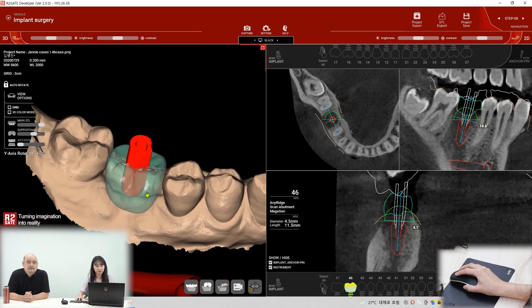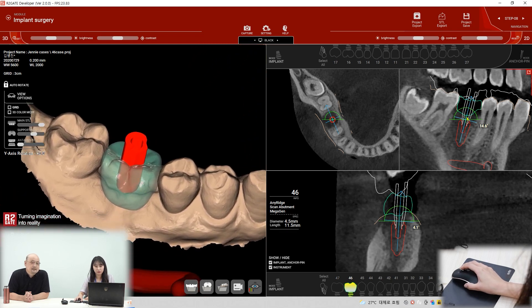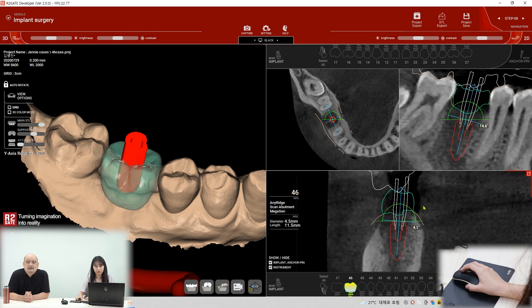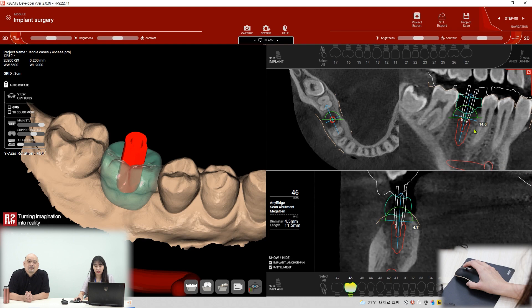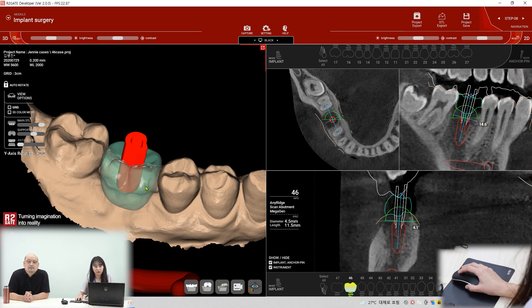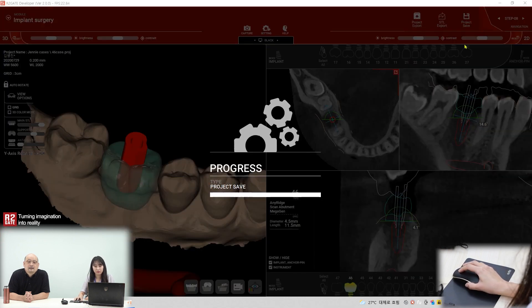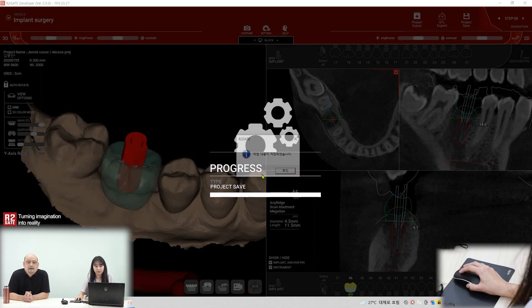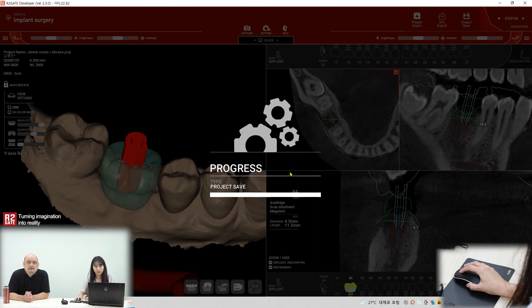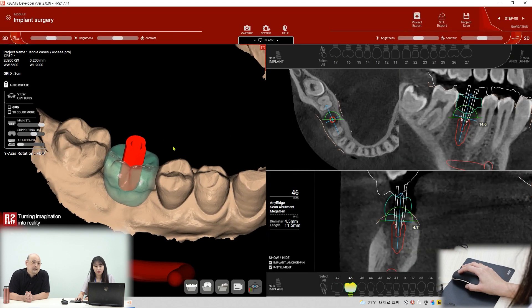That's our implant planning, and we have to save it first. The plan is fine — finish and save project. Same position name, okay. And we export to the STL file for the design.